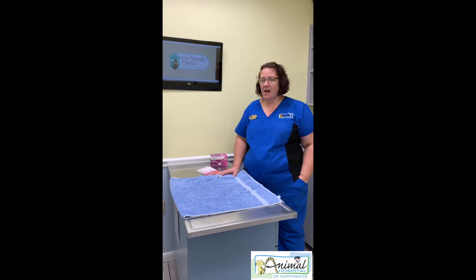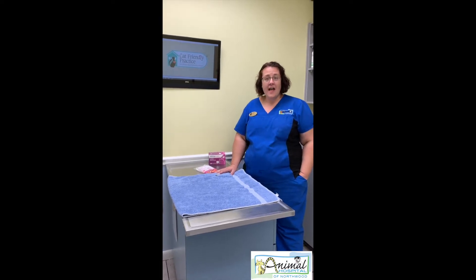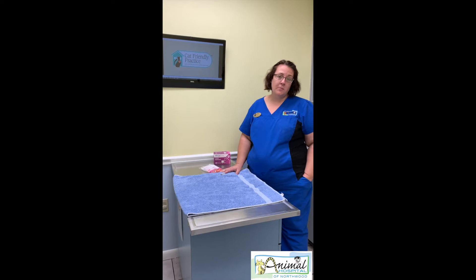Hi, it's April again at the Animal Hospital of Northwood. Today I'm going to show you how to give an insulin injection to your pet.